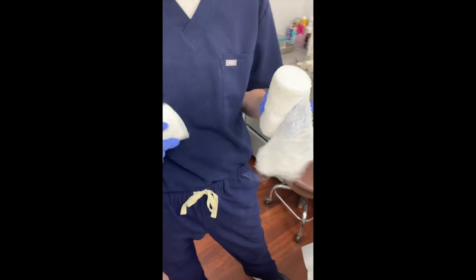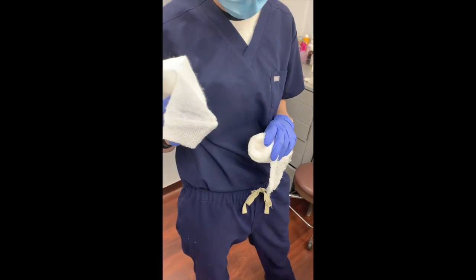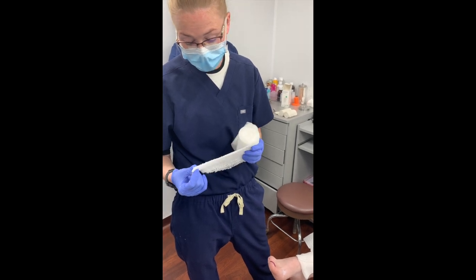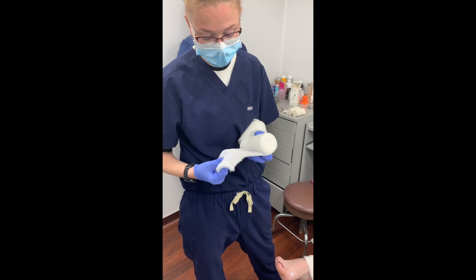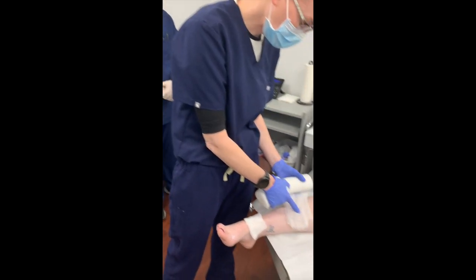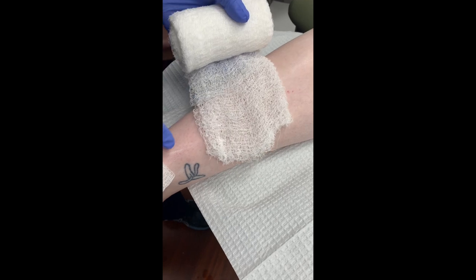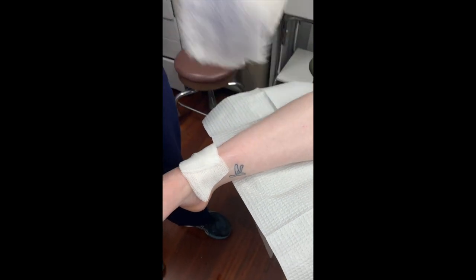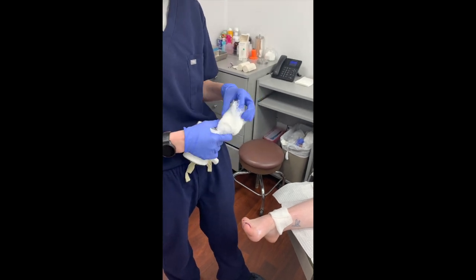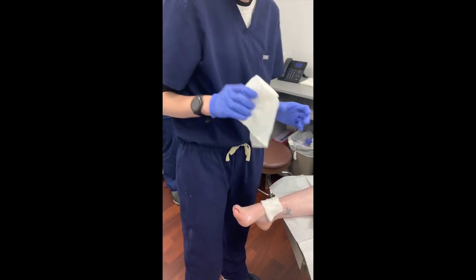A lot of our applications will be for wound care. The two first-layer options are the Curlex — which is more coarse, I remember it as 'coursey Curlex' — and the cast padding, which is the softer material. I usually start with the cast padding because it's softer to the skin and less abrasive. Curlex can be much more difficult on the skin, and if you have a patient with peripheral arterial disease, you can get a lot of friction, especially over bony prominences, which can actually lead to wounds.